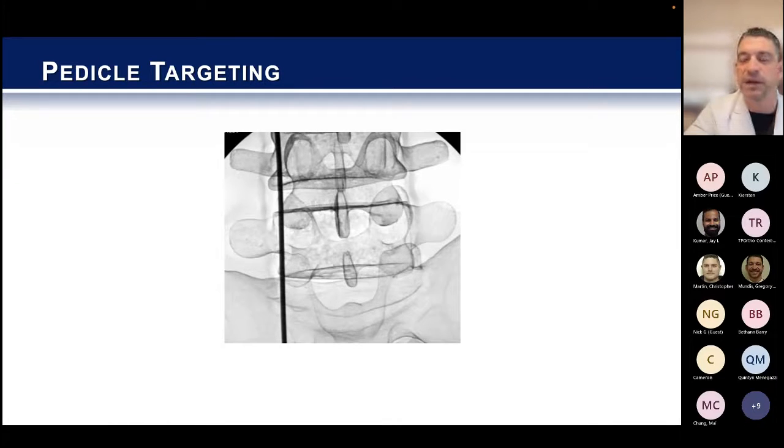Now, depending on patient size, my usual is somewhere between 4.5 and 5 centimeters from midline is where you're going to make your incision. And that stays pretty darn consistent. If you're doing a long construct, say up to like L1 or T11 or T10, then you're going to want to narrow that distance from midline because those screws don't need to be in such a harsh lateral to medial trajectory, and you won't be very happy with that. Because you'll be fighting skin at that point.